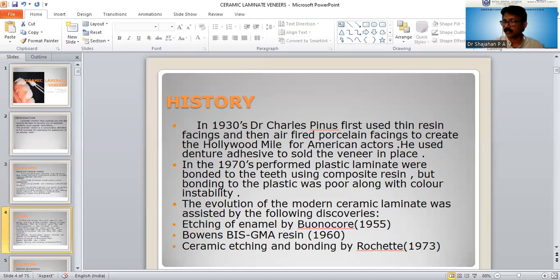To guide the tray into position, 3 stops of compound are prepared on non-involved teeth. A dam is constructed with compound to prevent distal flow of the impression material. When you remove the impression, only after the gelation of the agar is completed, the peripheral seal around the impression is broken and the impression is removed rapidly from the mouth with a single stroke and snap.